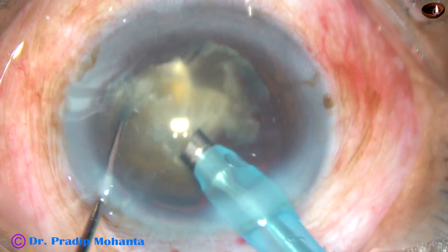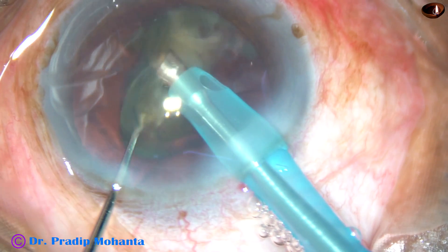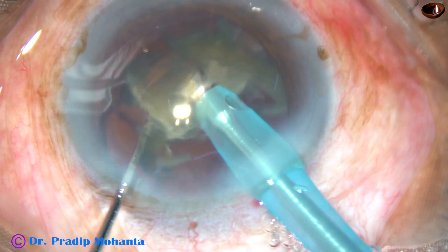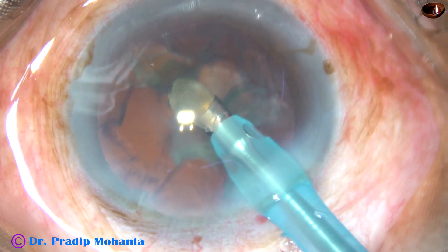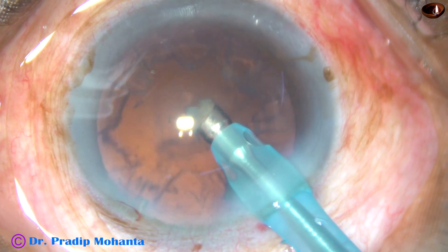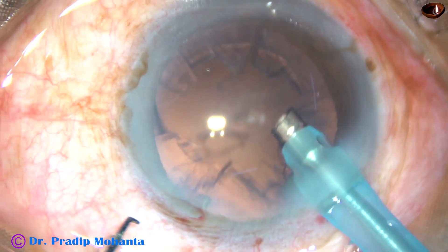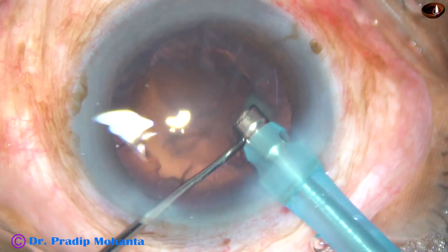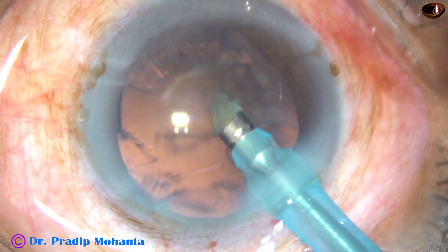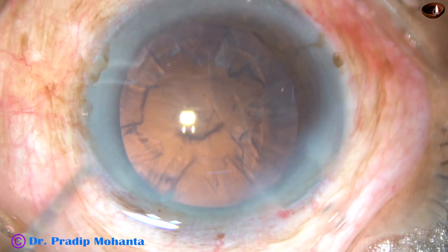Direct chop is a lot of fun. You don't have to make a trench. It saves a lot of time and a lot of ultrasonic energy. That's it — the nucleus is managed. And now this is a small nuclear piece that is removed.